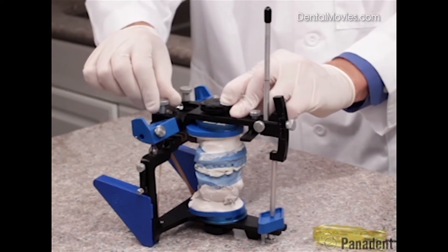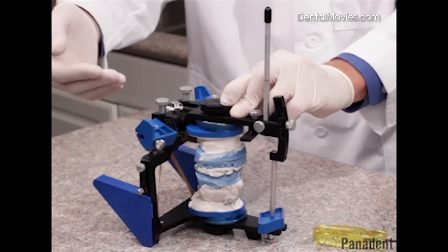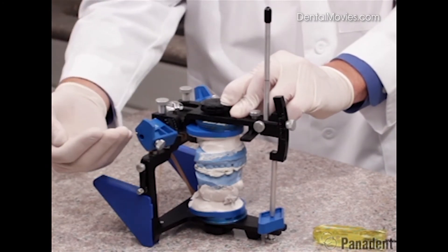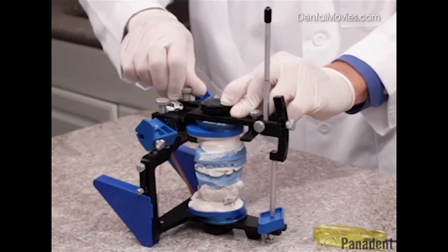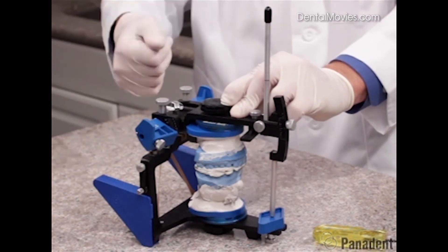We can now loosen the little screw here on the top which allows the motion analog to drop down to where the axis element is moved downward and forward, setting the protrusive angulation into the articulator for both sides.